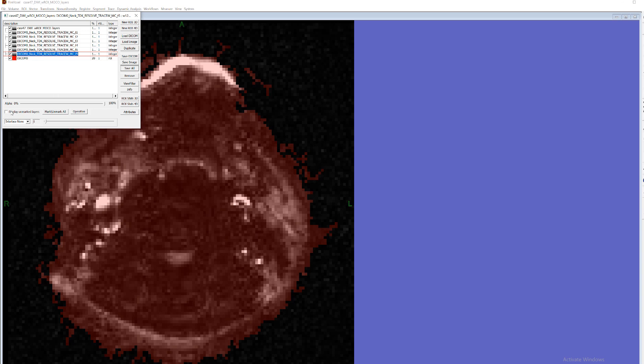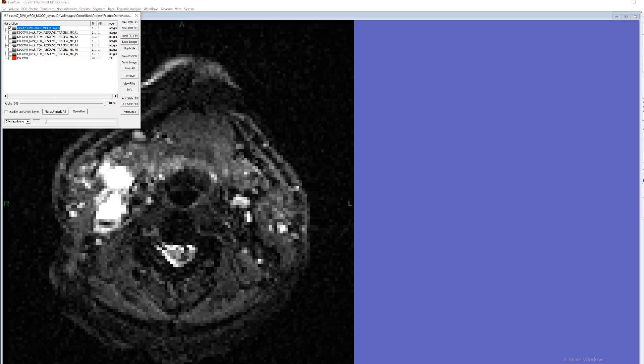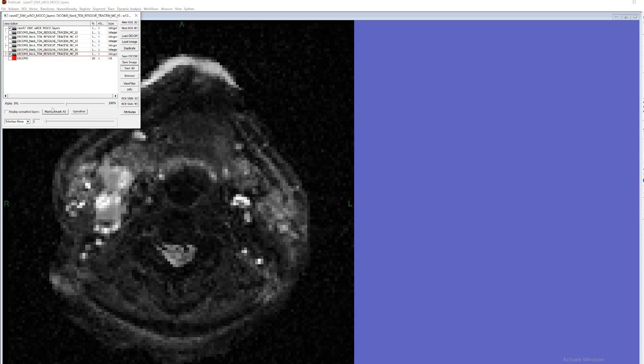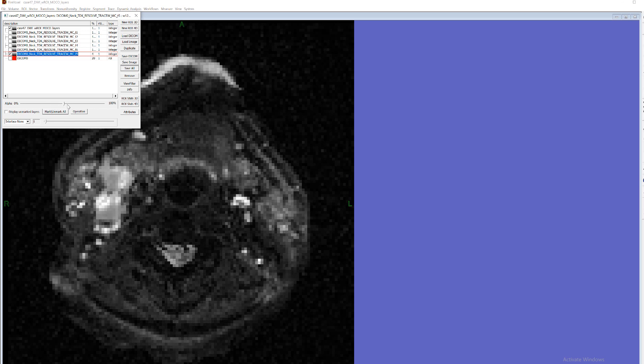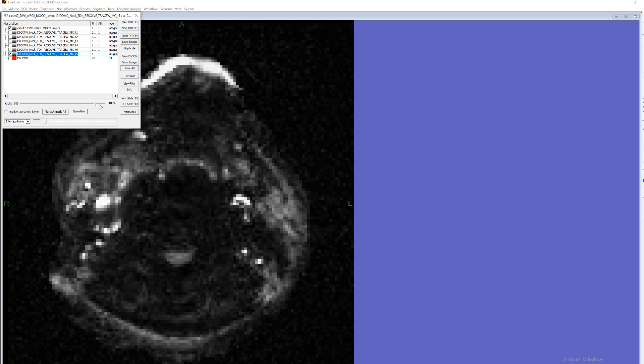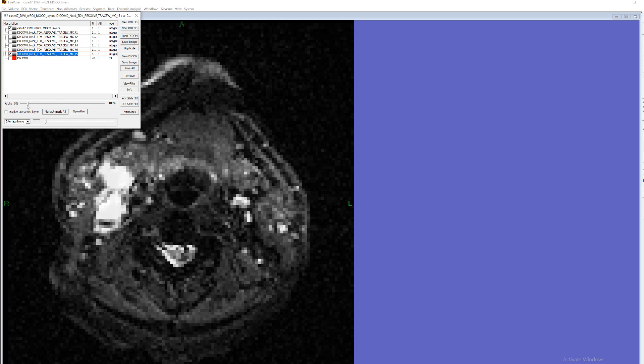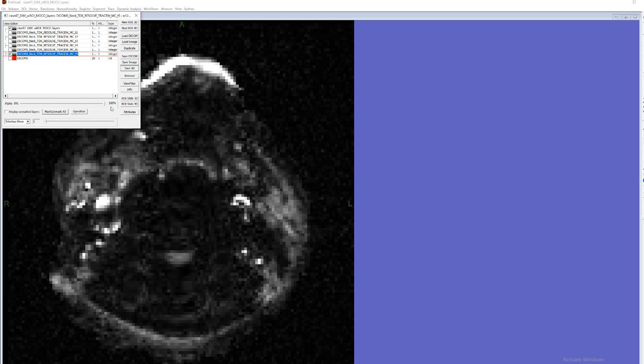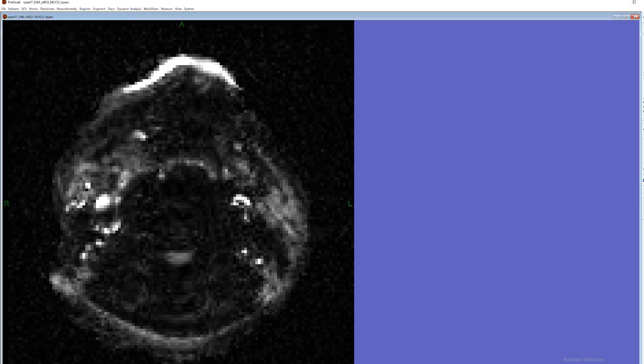The new document converts each separate time point into a separate layer in the order of the time points. So for example we could unmark them and then mark first and the last and then we can observe precision when they overlay.